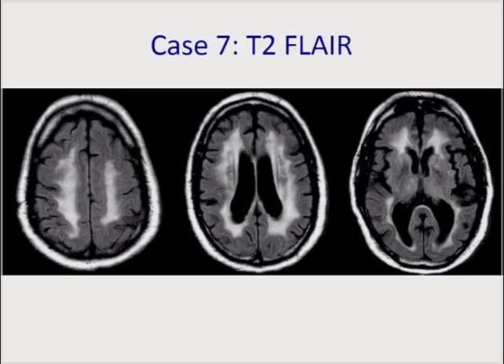We can see here that along both ventricles, anteriorly and posteriorly, there's substantial atrophy, but also these very confluent white matter lesions here. And white matter hyperintensities, as I referred to before, are not always consistently described in imaging reports. I think this is one of those contexts, also with atrophy, where it's really useful to look at the imaging yourself in the context of the patient who's in front of you, because sometimes it can inform your thinking.